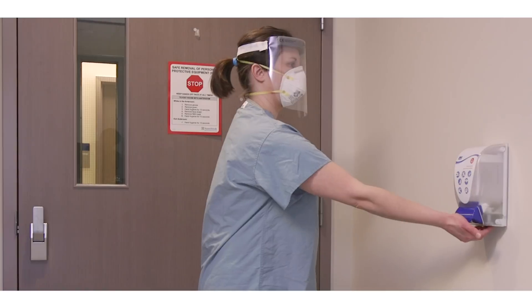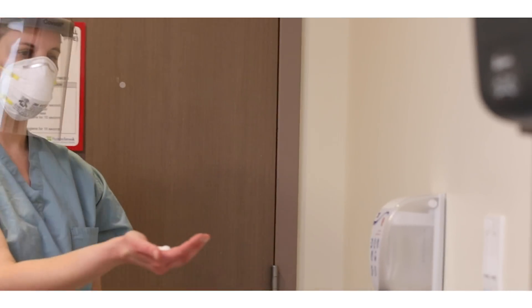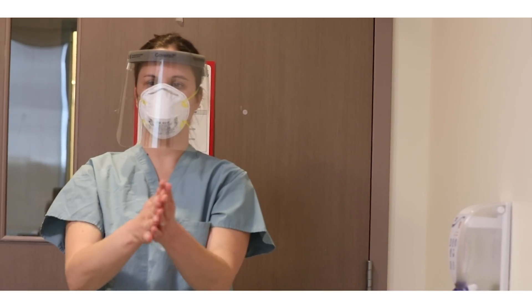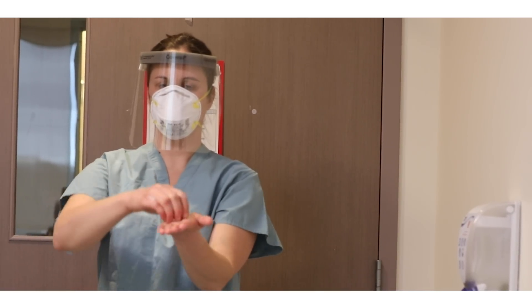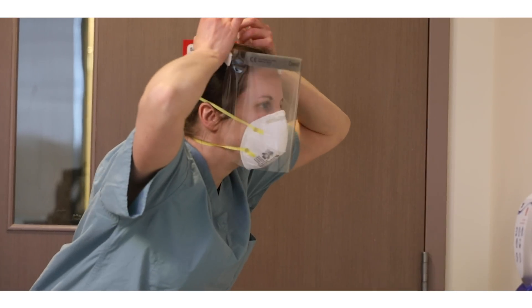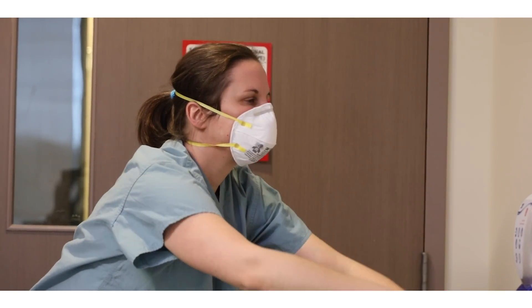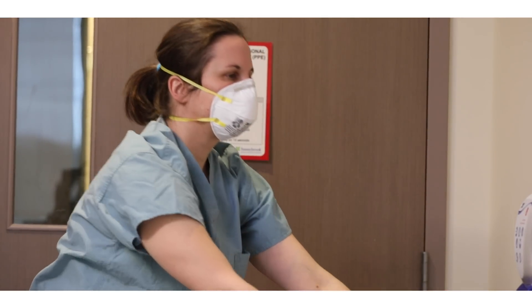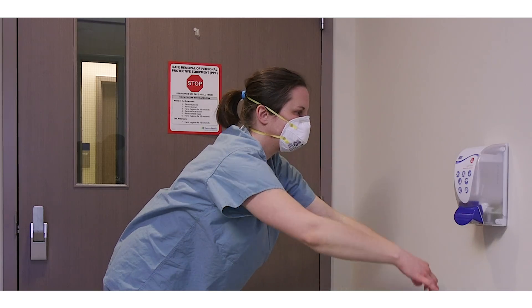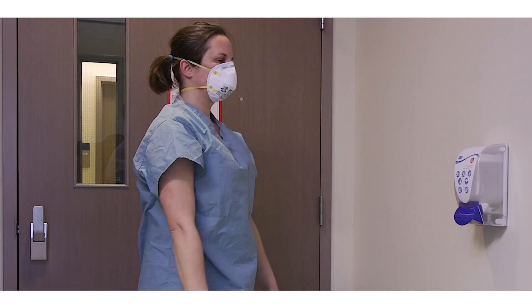Perform hand hygiene for 15 seconds. Remove the face shield by grabbing the strap at the back of your head. Slowly remove it down and away from your face using the sniff position — bend forward, eyes forward, chin out. Dispose of the face shield in the garbage.